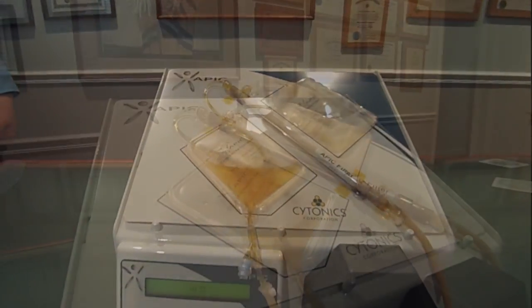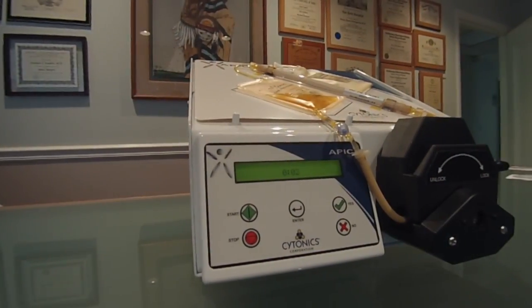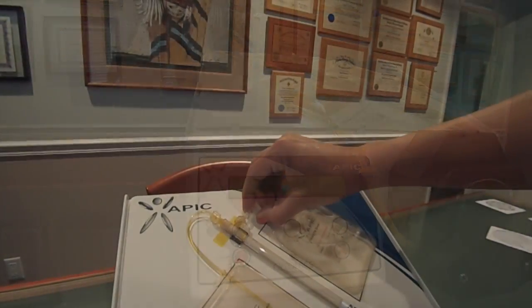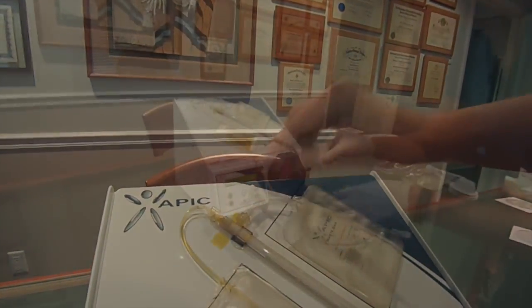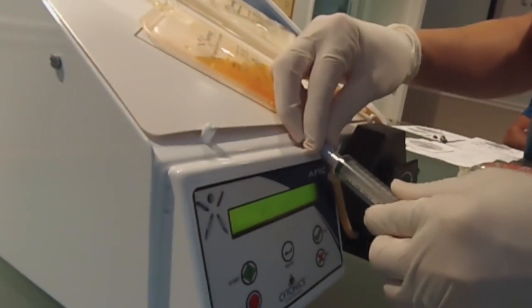Press start to begin the 20 minute cycle. The waste bag will begin to fill up as the volume in the concentration bag decreases. Once the cycle is complete, the pump will read APIC ready. Close the clamp on the waste bag and the concentration process is complete. Alcohol wipe the blue port and connect the syringe to withdraw the APIC.